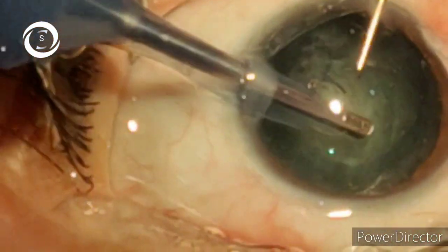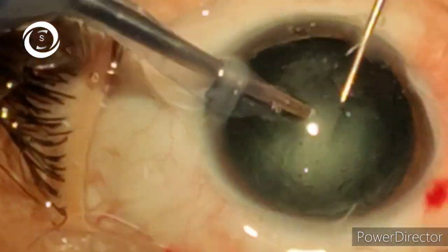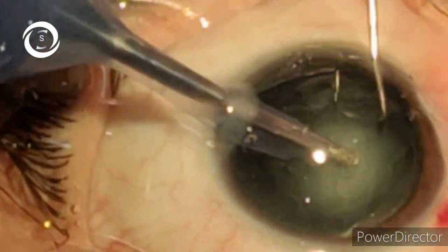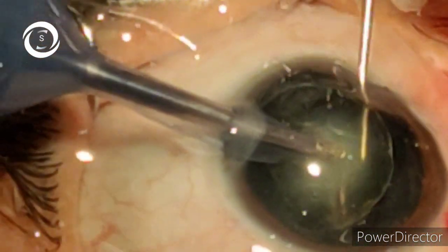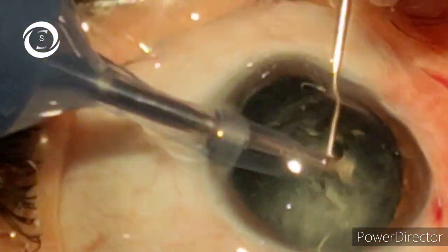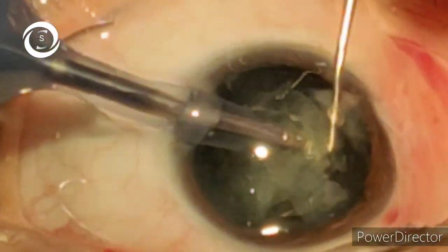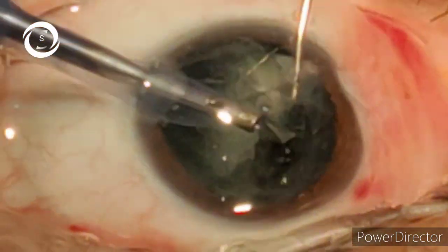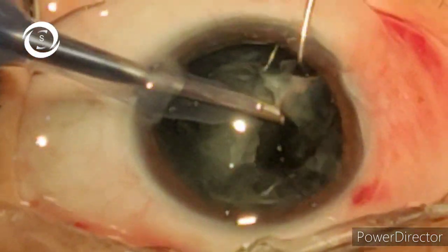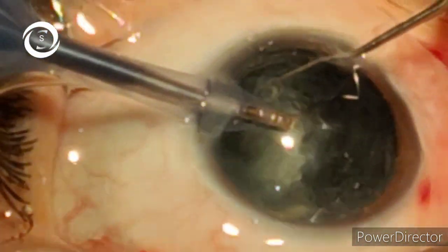Then push the phaco probe into the center of the nucleus after removing the soft cortical matter with high vacuum — 400 or 450 — and low power setting. Enter it into the nuclear substance at step 3 in a phaco step. Make sure it is deeply buried and engaged in the nucleus.